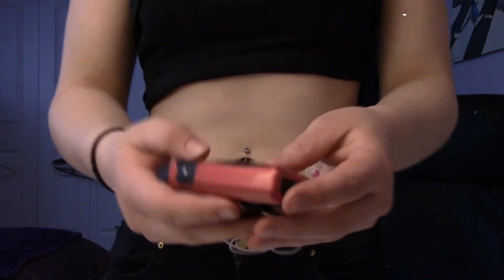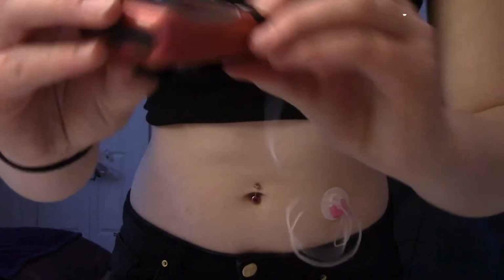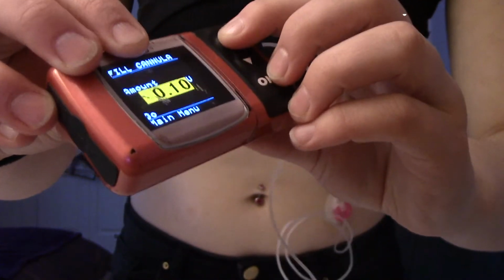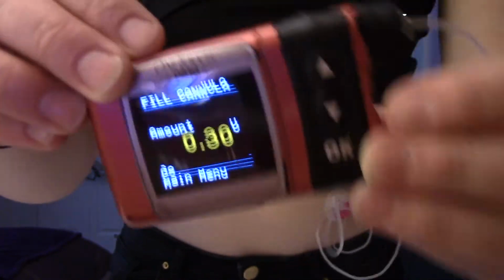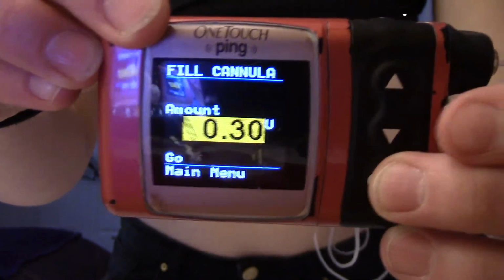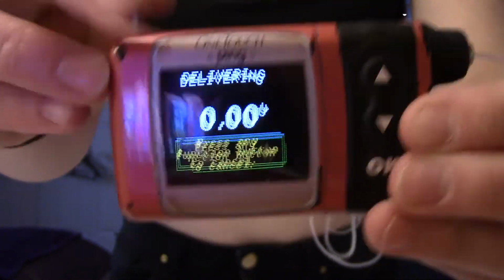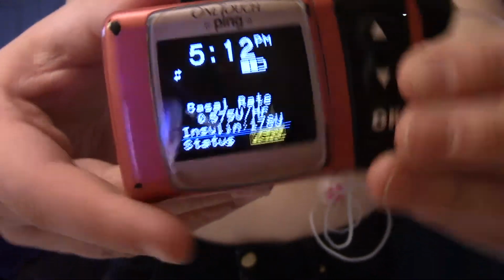And in the booklet it says put 0.3 units in to fill your cannula. So, 0.3, and then I'm just going to press OK. OK. Perfect! We have now primed our insulin pump and you are ready to go.